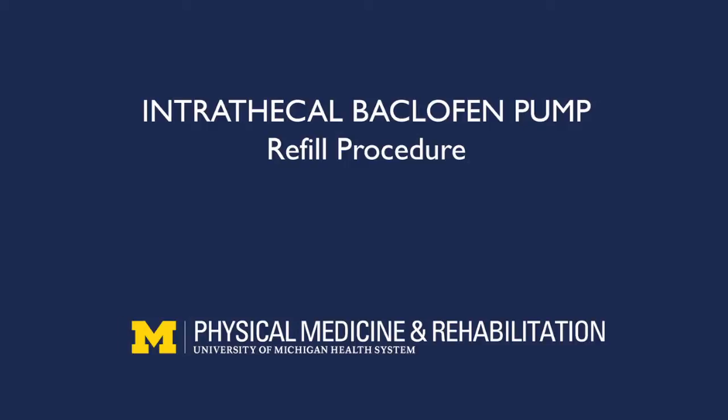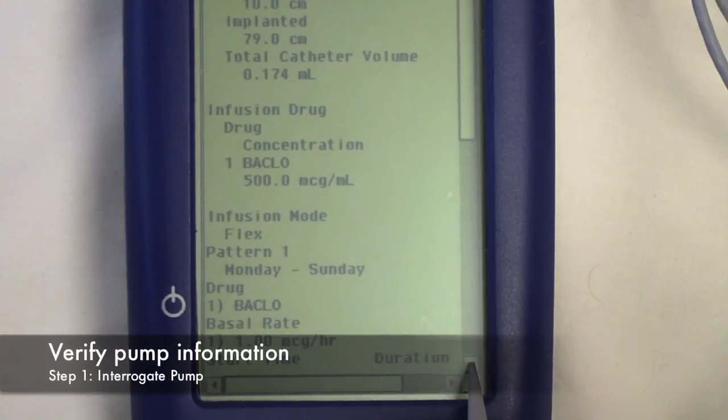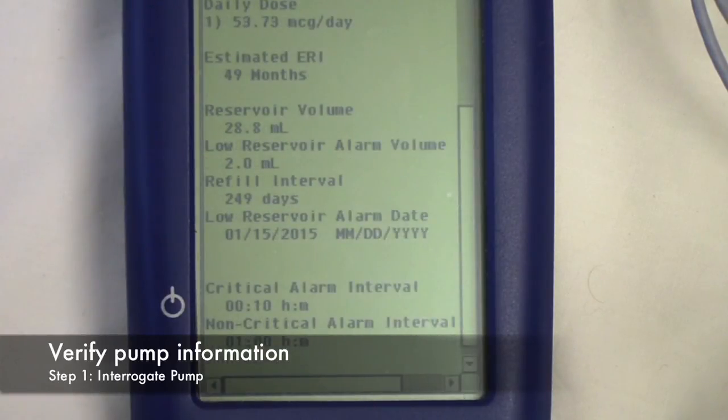This video briefly describes how to refill an intrathecal pump. Step 1: Interrogate the pump — see the interrogation video for details. After interrogation, note pump information, especially the drug concentration, expected residual volume, and reservoir capacity.